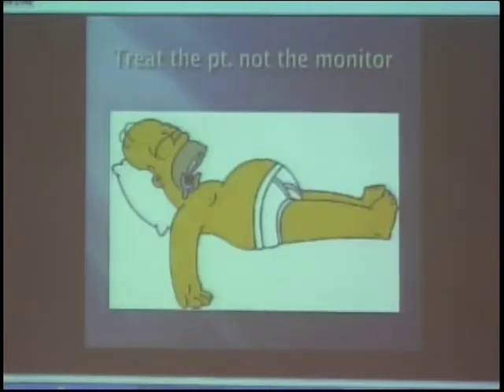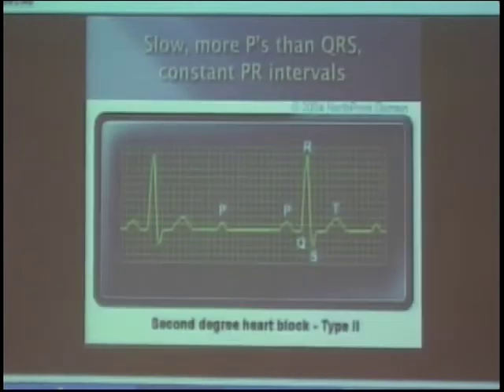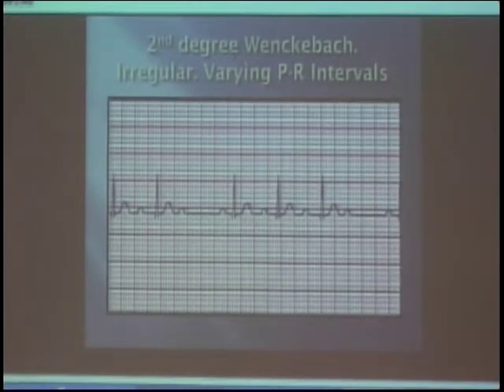Those are special dogs. But are you pacing because it's Brady or because of the block? Well, I kind of went from my original presentation, which is bradycardia, and then I threw in some blocks just to cover that part of it. But you treat them differently. So you're pacing the Brady then? I'm just pacing the second degree type 2.